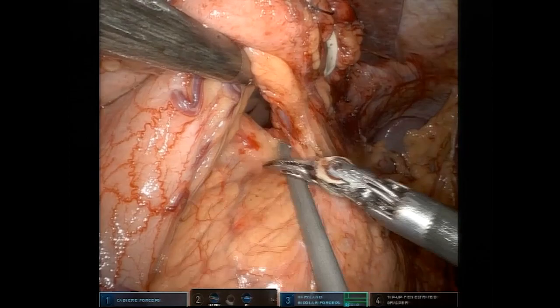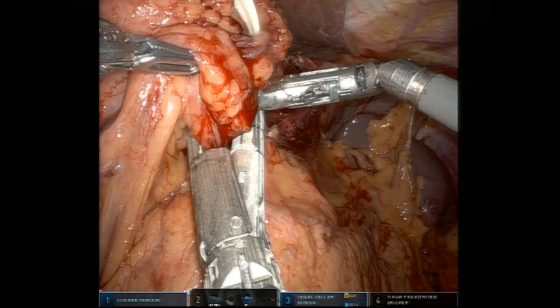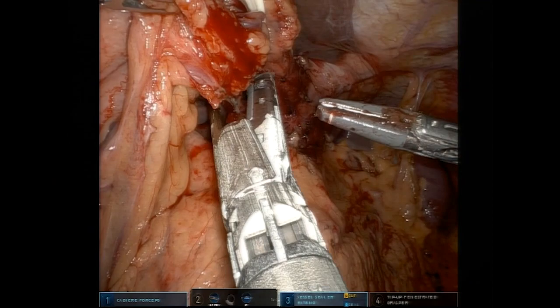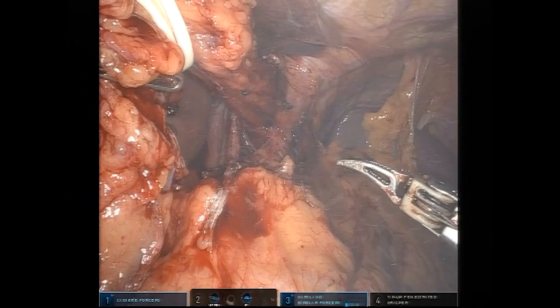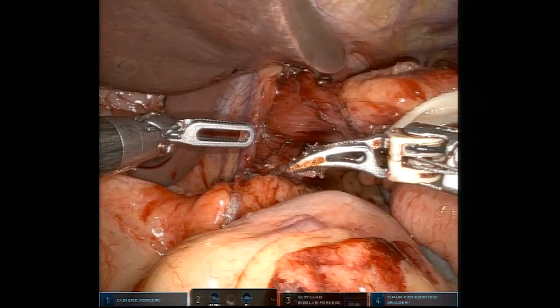We then identify and isolate the left gastric artery. It is skeletonized to facilitate stapler division. The esophagus is further mobilized into the chest until we connect with the previously mobilized intrathoracic esophagus.